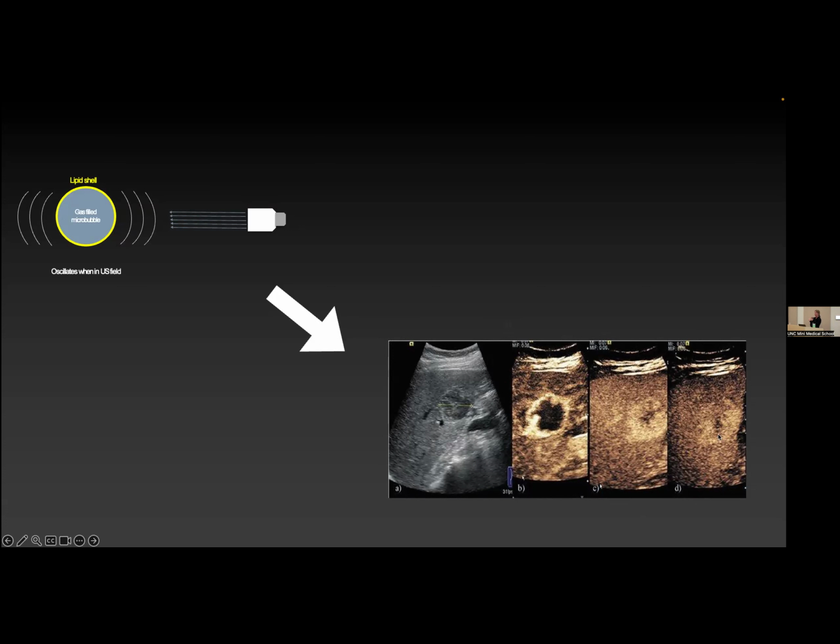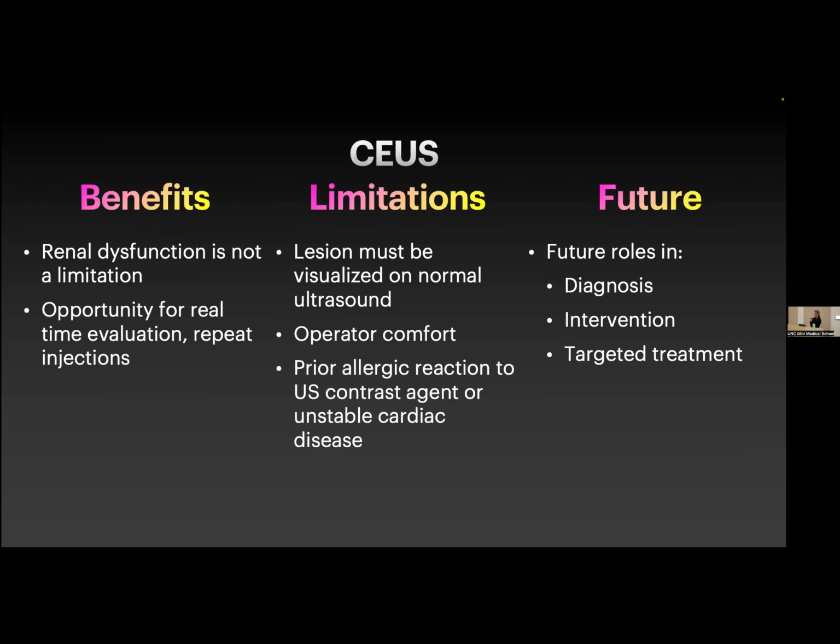And with that picture, I can use my knowledge of how a liver mass would look on CT or MRI, because this is pretty much giving us an equivalent of a multi-phase CT or a multi-phase MRI, and say that's a benign mass in the liver. That's what we call a hemangioma. So don't touch, don't biopsy it. This is benign. It's not going to cause any cancer, has no cancer risk. So being able to use this is wonderful.